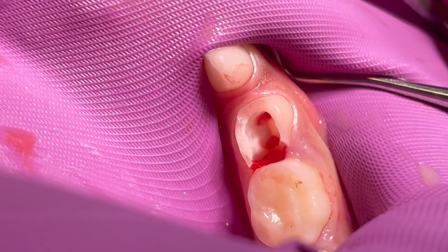MTA has such a high success rate partly because — compared to ferric sulfate or formocresol, which are caustic materials that force the pulp stumps to stop bleeding — with MTA I really have to have a very healthy apical pulp portion before I place it. So the success rate reflects that we're selecting truly vital, healthy cases.